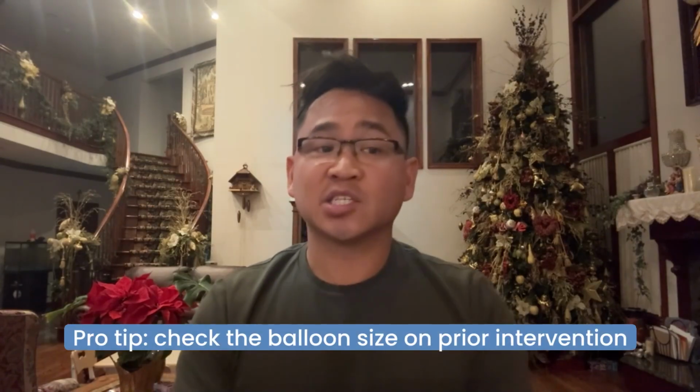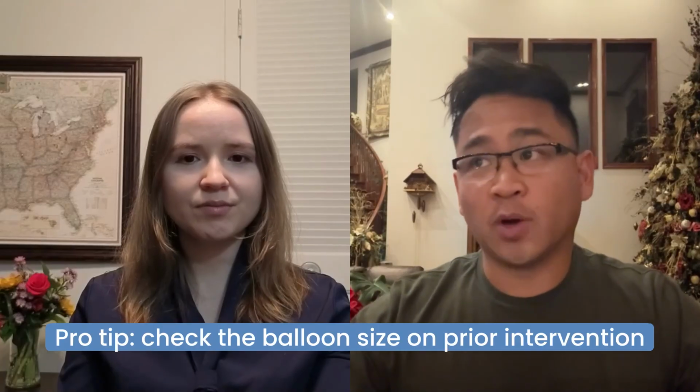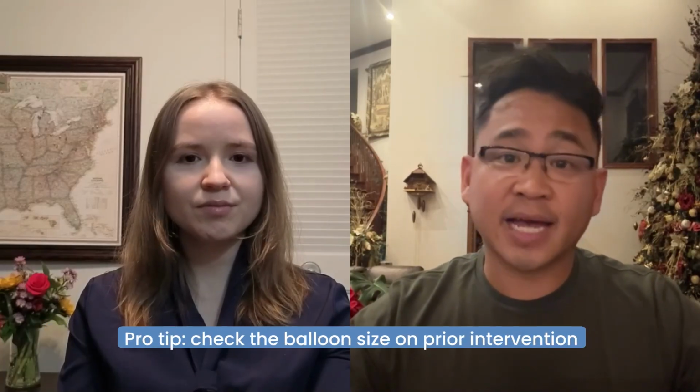And then if there was a focal stenosis on the prior study, that's what I would expect would be the plan. You can also look at the size of the angioplasty balloons that they used and decide if you want to go straight up to that size and or go a little bit bigger. It'll also help to determine the direction and the site you want to get access, whether you'll need one or two, and whether you'll need to plan for possibly an embolization or a stent. Make sure you have that equipment available, which most institutions would have.